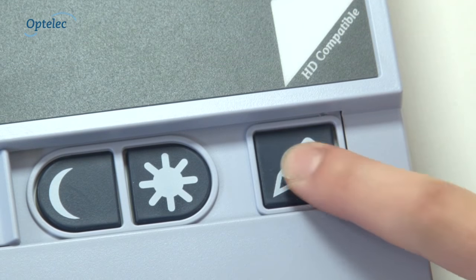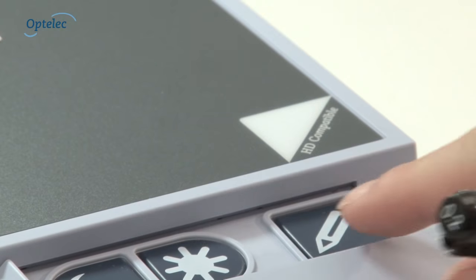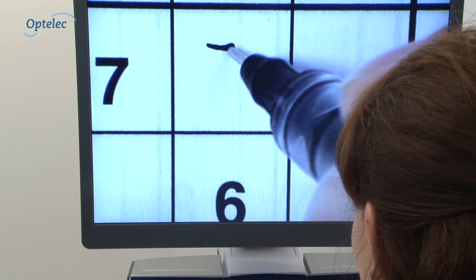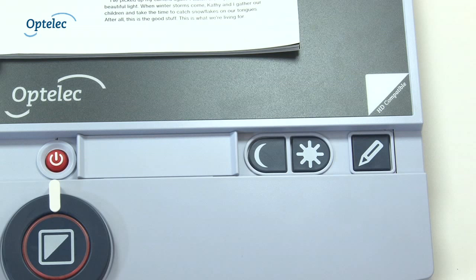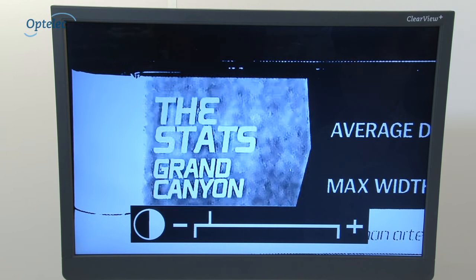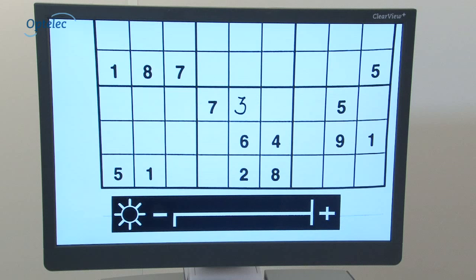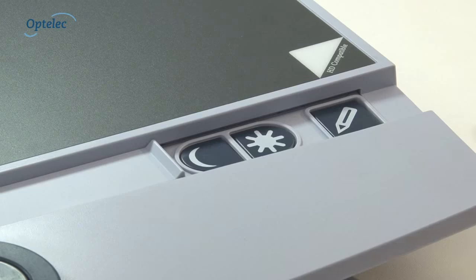Whilst writing beneath the camera, press the button with a pen icon to switch off the autofocus facility so that the camera doesn't focus on your hand. Use the image control button to adjust the visibility of words that originally appear on a coloured background. If you're sensitive to light, you can adjust the brightness. Once adjusted, the buttons can be covered again.